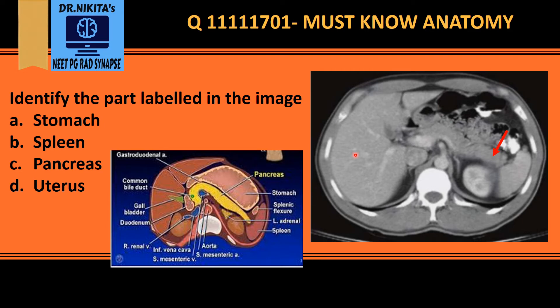The spleen is the organ on the left side. In this image we can see the pancreatic head, body, and tail in relation to the spleen. This enhancing organ is the left kidney, the organ on the right side is the liver, and this is the aorta with the superior mesenteric artery branching from it. So the labeled part here is the pancreas.